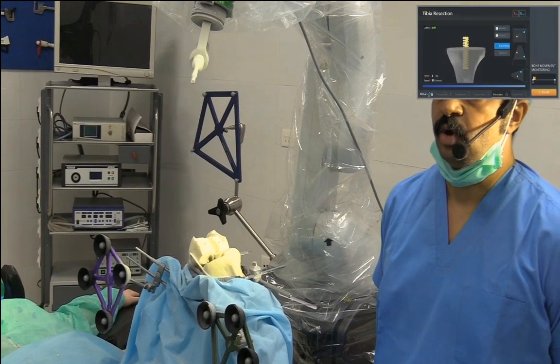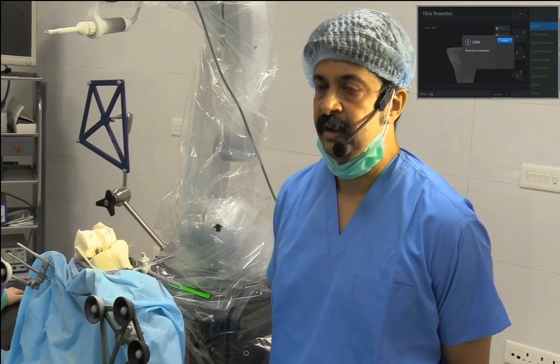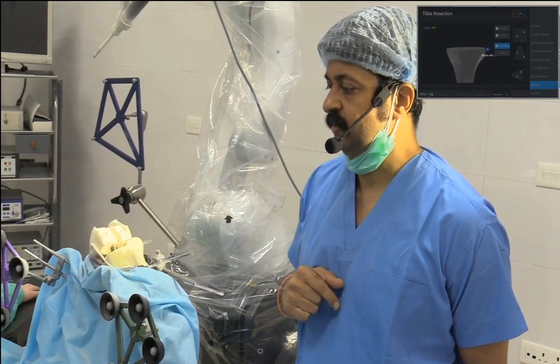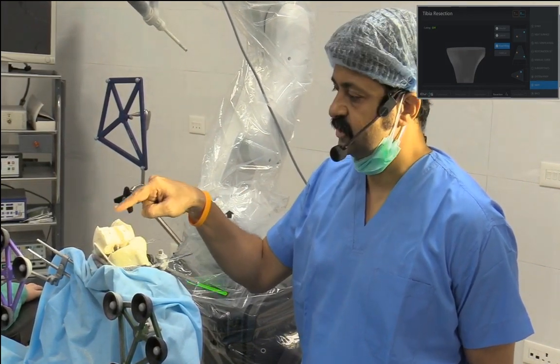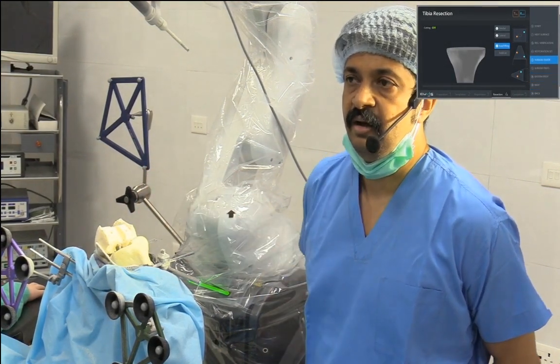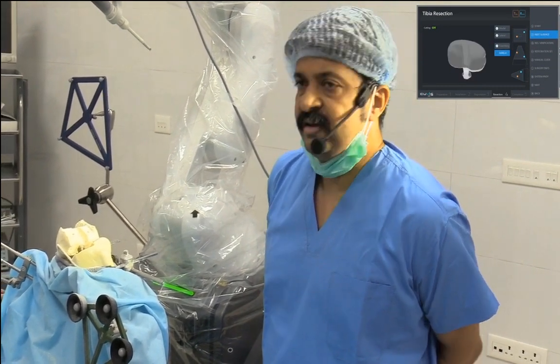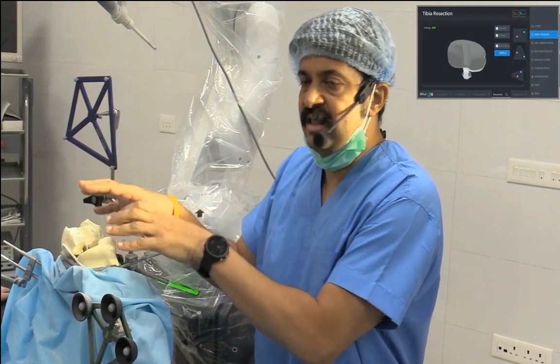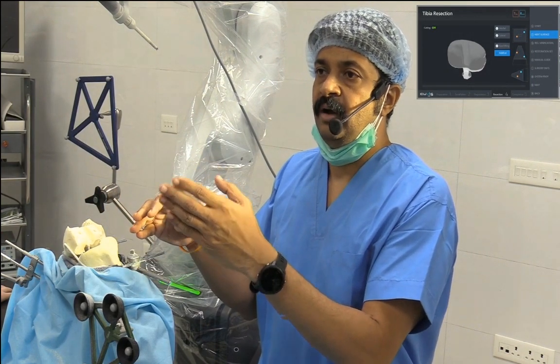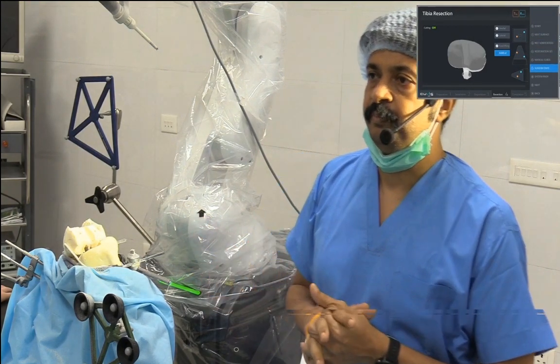So as you all saw, all the cuts are completed now finally. The beauty of this is the cylindrical cutter can do the peg holes, the box cut, as well as the keel, and create the keel wings as well, which not a single system is capable of doing today. Now in case, after I am ready to put my trials in, I feel that I want to add a cut, you can see that there is an add cut provision. So all of that is possible.